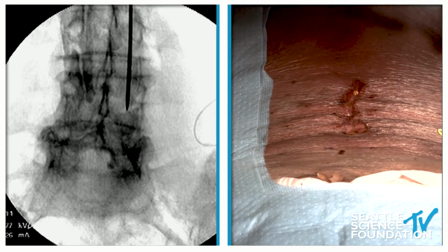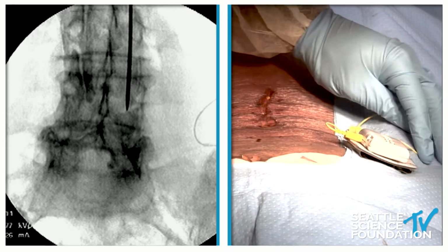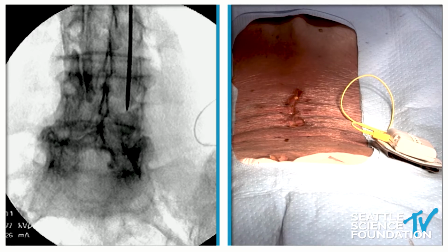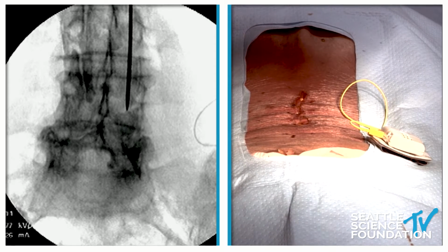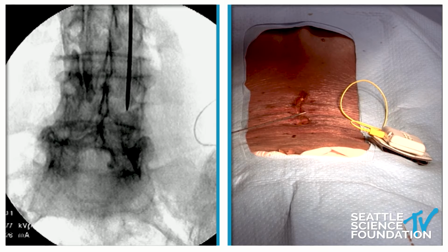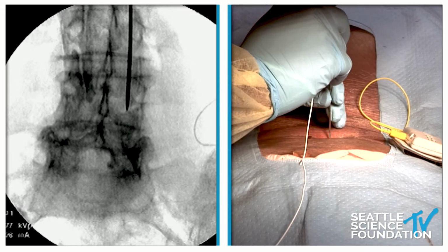If the camera can see here, what we have is the EPG from this company, which has a MagSafe connector, which is going to allow me to test stimulation once I get that down on the patient. So this is what the needle looks like with the introducer and the cannula. This is everything put together. Here, I'll put it into the camera view so you can see it there. And then basically, you just go straight coaxial with the two needles.